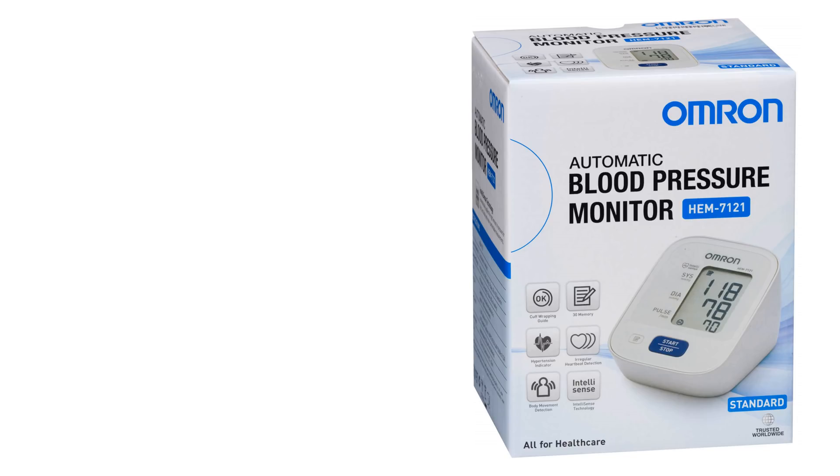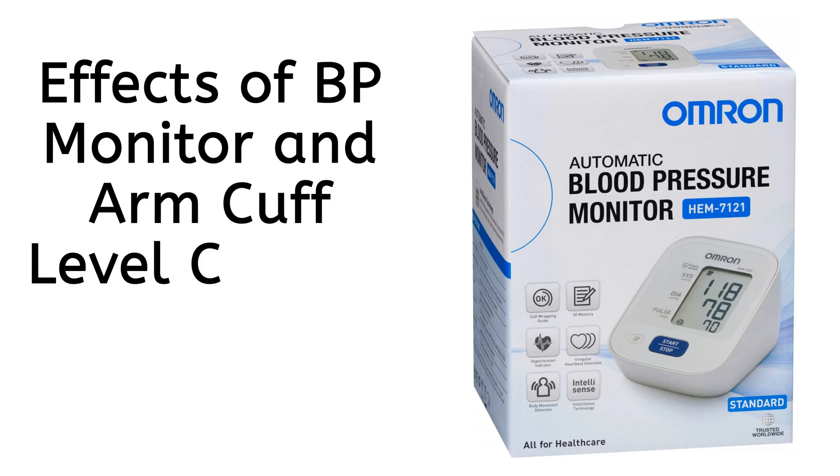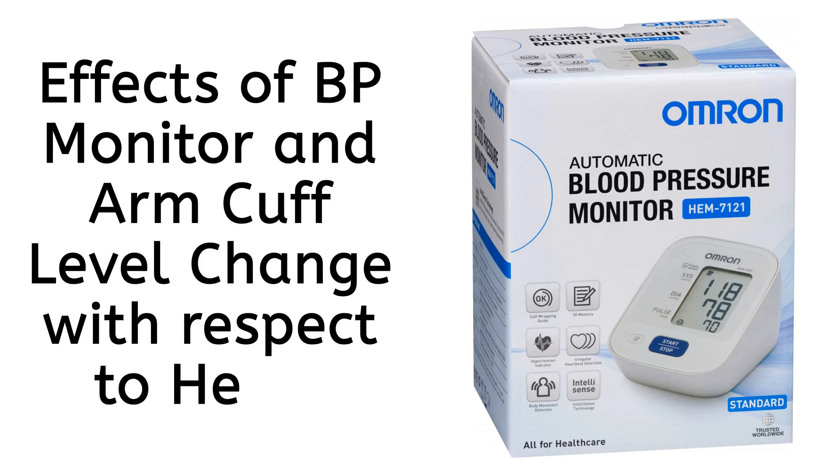A few days back we reviewed a blood pressure monitor by Omron, and this video is about the effects of BP monitor and arm cuff level changes, with respect to the heart, on blood pressure.